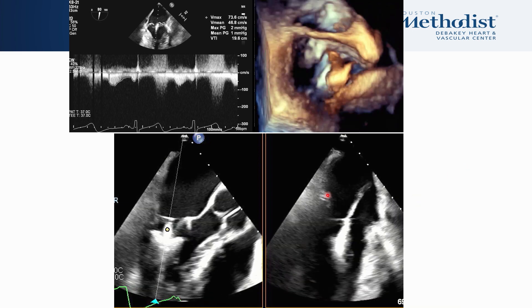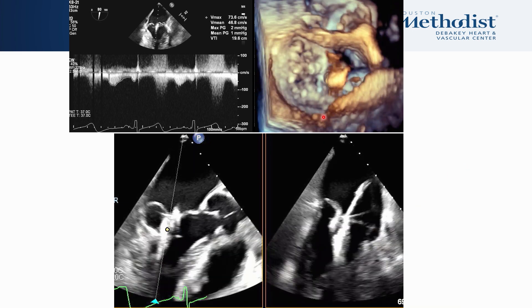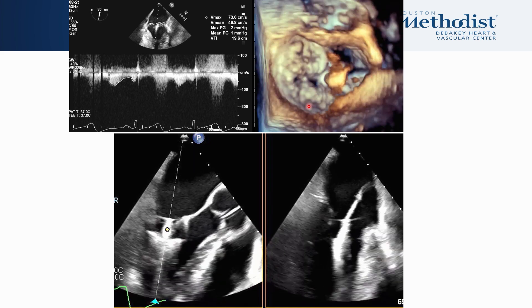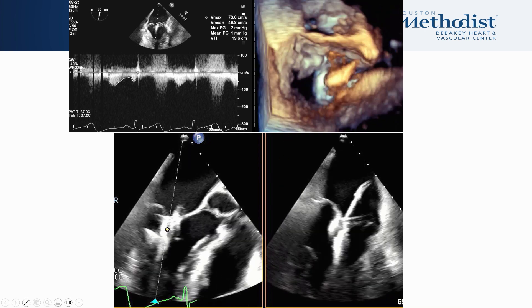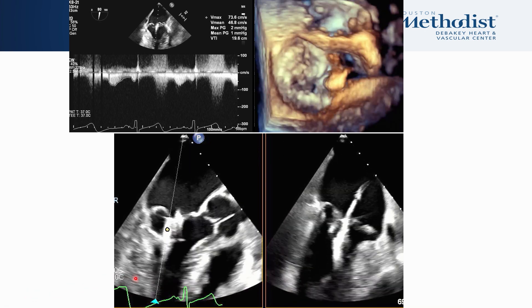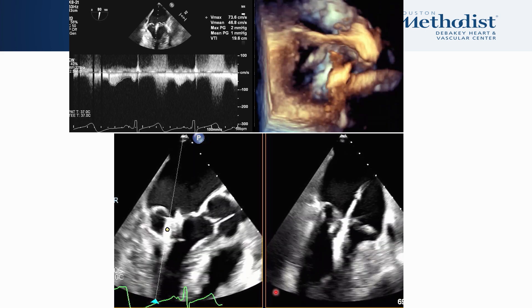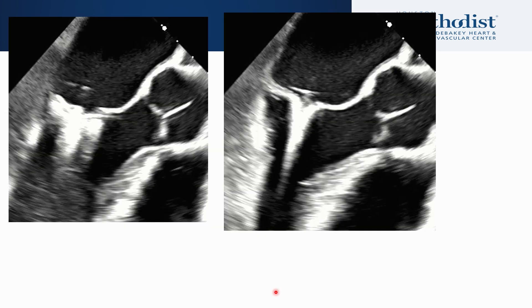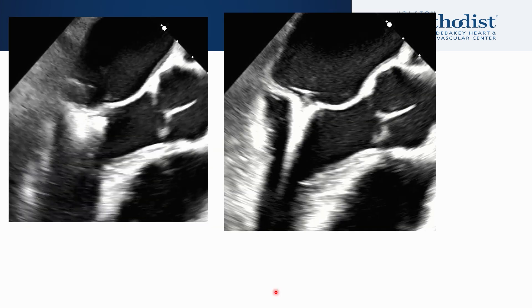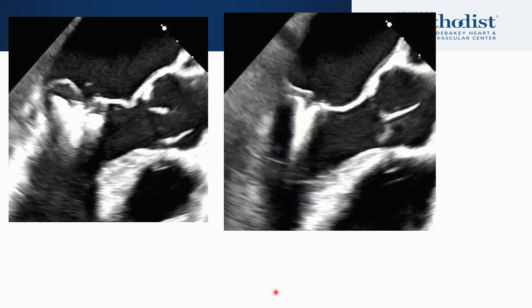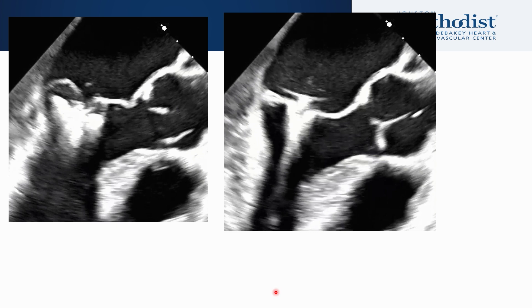We then bring in a second clip — also an XTW clip — oriented more in a 12 o'clock to 6 o'clock orientation, perpendicular to the line of coaptation. The corresponding 2D long axis views demonstrate the clip underneath the mitral valve. Carefully, the clip is retracted and the anterior and posterior leaflets are grasped. You can see the grippers are bouncing, indicating the leaflets are between the gripper and the clip arms. The clip is closed, demonstrating a good grasp.